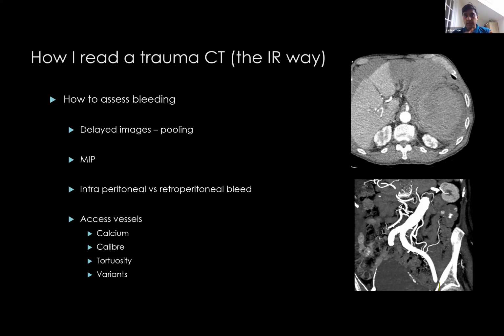I've already told you the places that I look at. Now, how do I actually assess the bleeding, right? The first thing that I look at is for delayed imaging, right? Now, in a Bastion protocol, obviously, the imaging is already delayed.